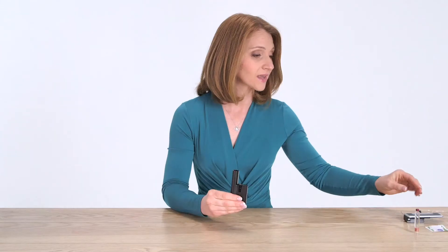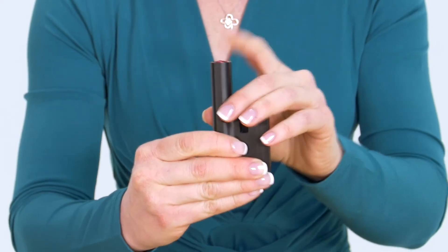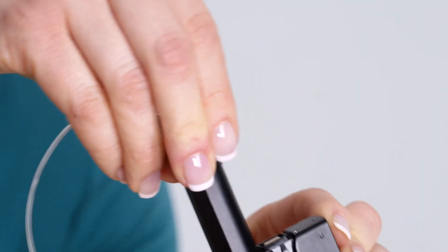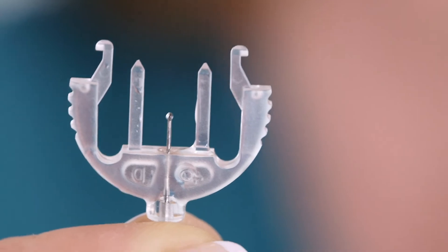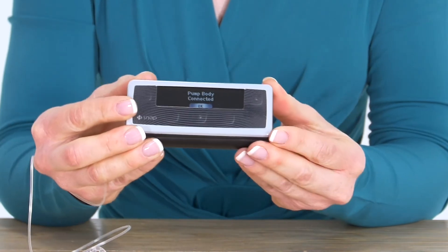I simply take my pump body, I remove the white adhesive tab, I take my pre-fill cartridge, drop it into the pump body and push down, and then I wipe the top with alcohol. I then take my infusion set tubing and as I push down to attach this to the pump body, I will notice that a few drops of insulin appear at the end. This is called the automatic tubing prime, which means that the tubing is already filled with insulin. I then take my pump body, simply attach it to the controller — I'm connected and I'm all done.